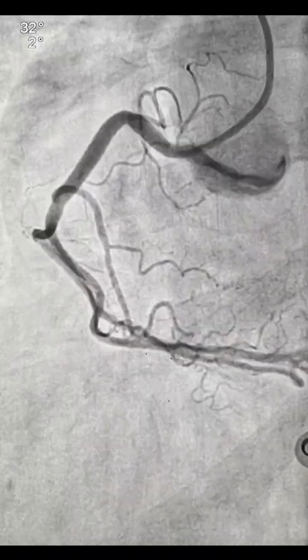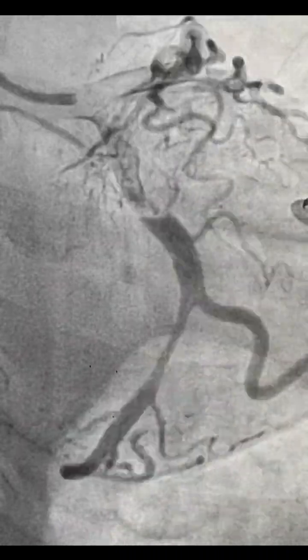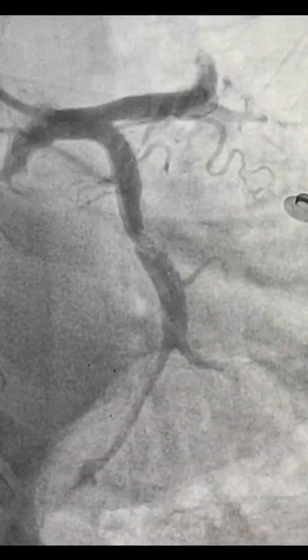You can see the RCA was normal and codominant, and in this case the LCX is almost around 5.5 to 6 in the proximal, and distally probably a 4. So after all clearance, we decided to do angioplasty to the proximal LCX and the distal LCX.